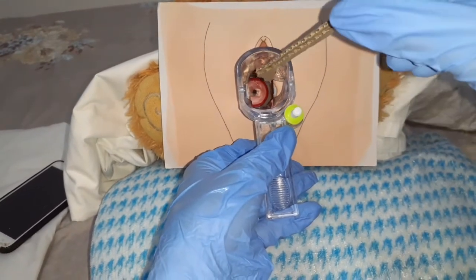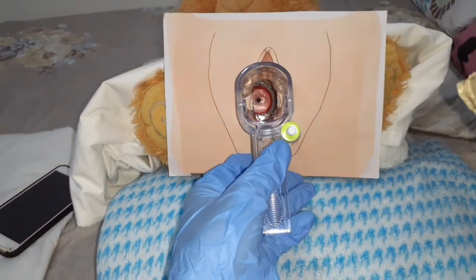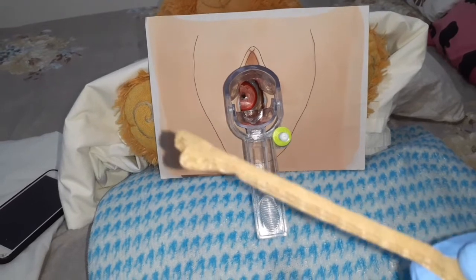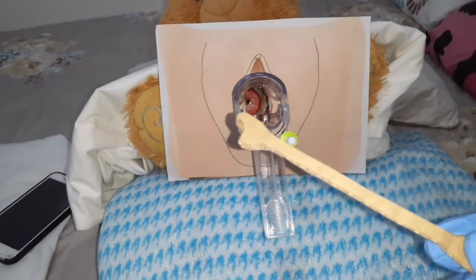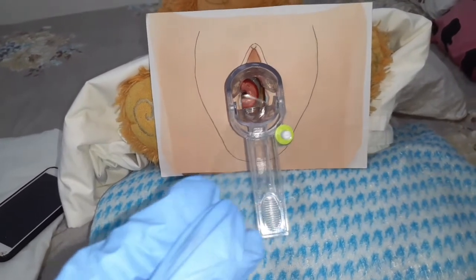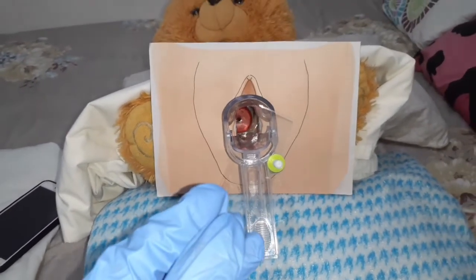Then remove, carefully not touching the side of the vagina. Then smear it onto another glass slide, making it as thin as possible. Then again, spray with a fixative.